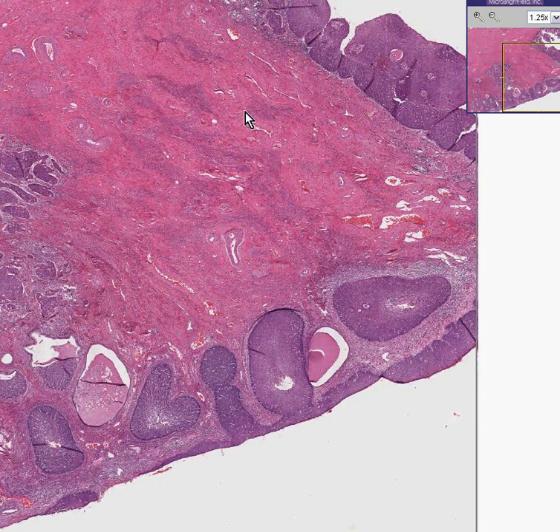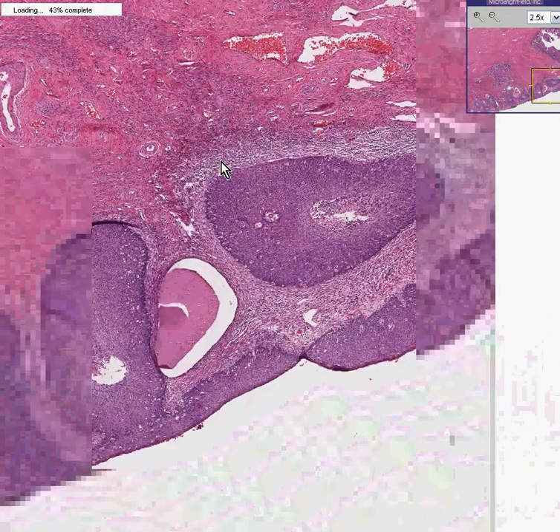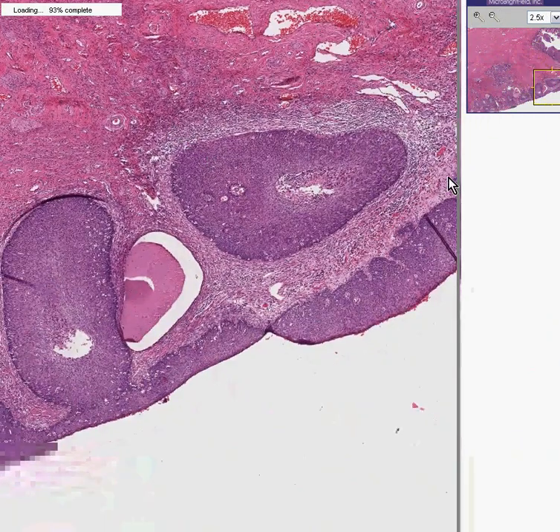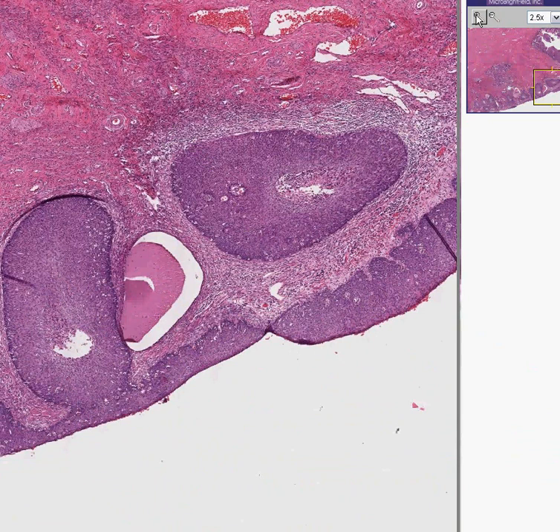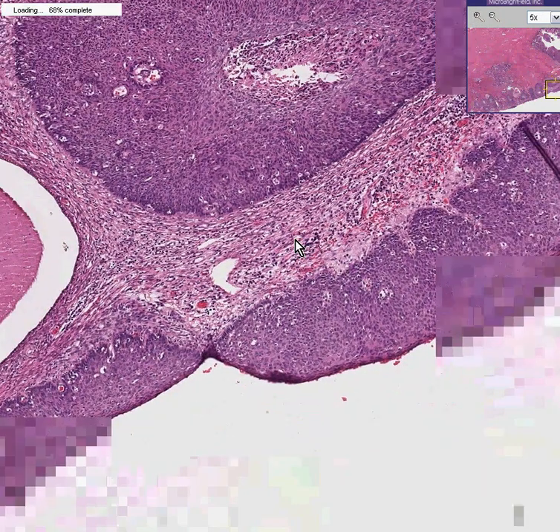Another cervix here. By now, we are really, really good at diagnosing squamous cell carcinoma in situ, because this is obviously what we have here.